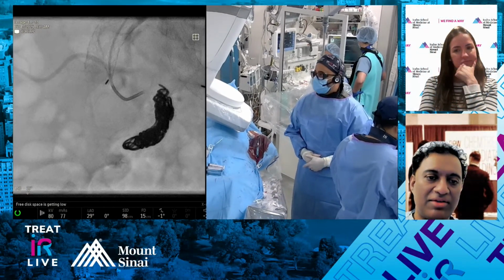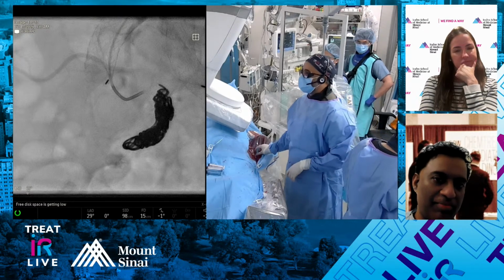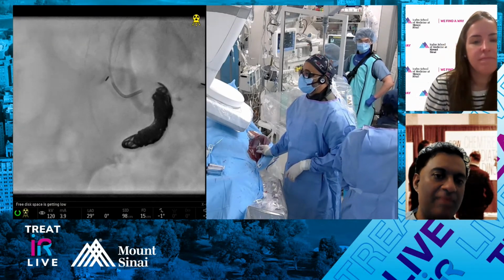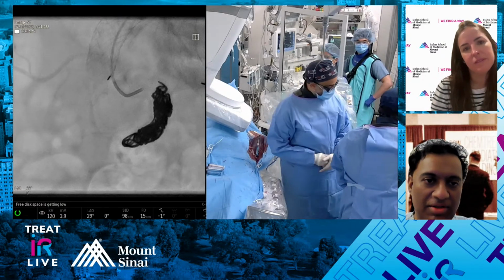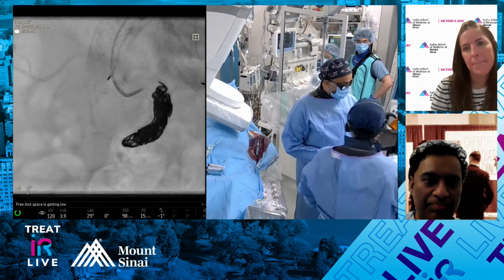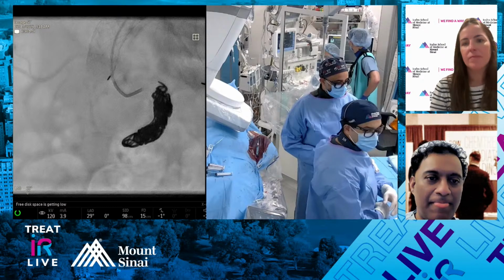You've shut down the anterior posterior division. There is a little bit of flow into that, which may retrofill, but I don't think it's likely. But if you throw a little bit into that horizontal portion, even a short 20 or 30, and just kind of fill it, probably fine.